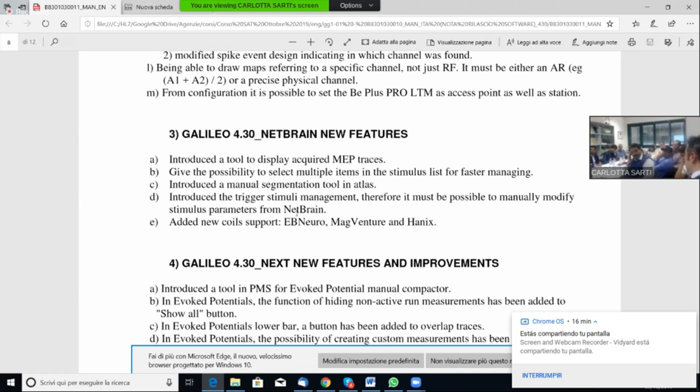You have your patient in the seat in front of the system, and with this type of device, you can recognize the position of the magnetic stimulation point, and you can repeat the exact point of this magnetic stimulation. You can create this type of therapy for the patient. You stimulate the same exact points of the brain of the patient, and you can repeat this type of therapy.